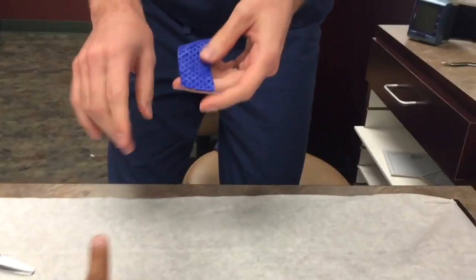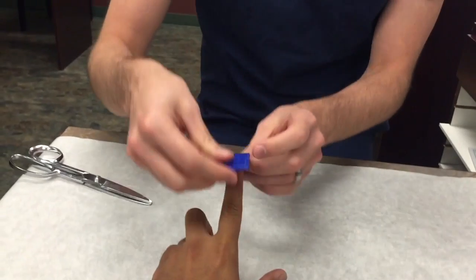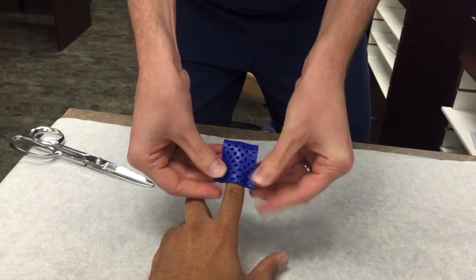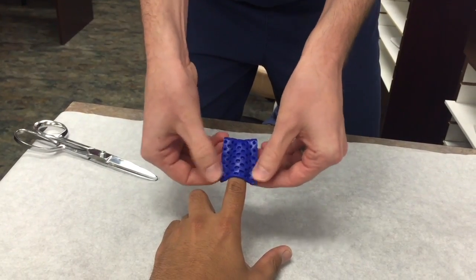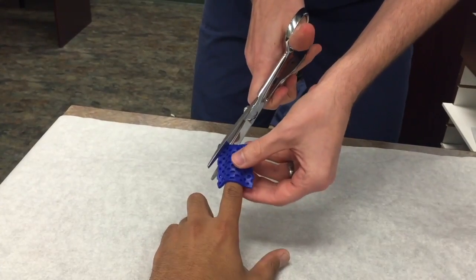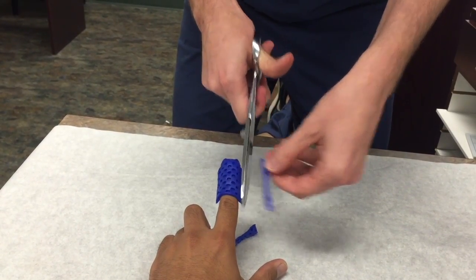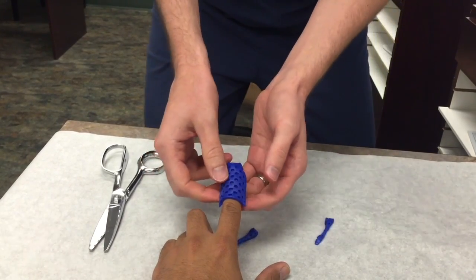Just give me one finger. I usually have them bring it up high, and depending on if Dr. Bronstein wants this joint free, I'll just put it on like that. This would be for an amputation, or if they just don't want to bang it on something. That's pretty much all you do.